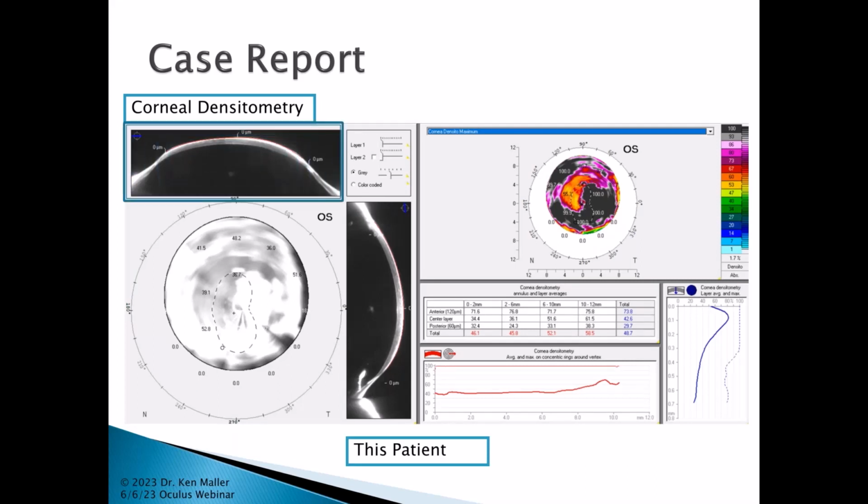Up on the top here, we can see that we have the scarring in that white reflectivity, both in the horizontal and in the vertical. You could see in the major picture that this is a much whiter appearance, and you can also see by spotting some of those numbers from the center at 36.7 out to some of the higher numbers in the 50 range there, that this is a much more reflective cornea.